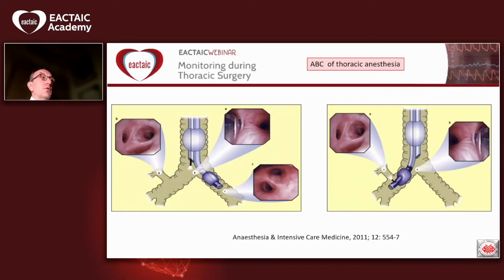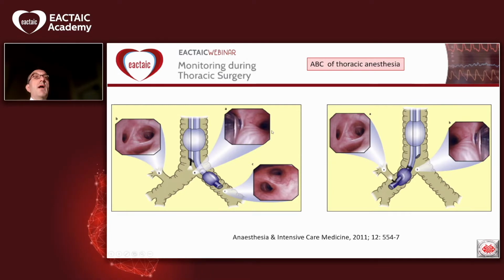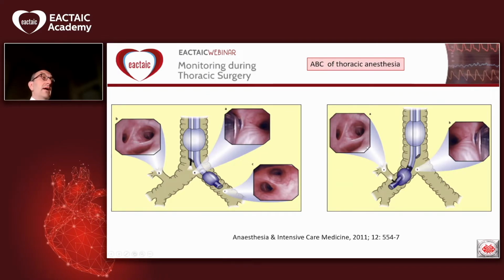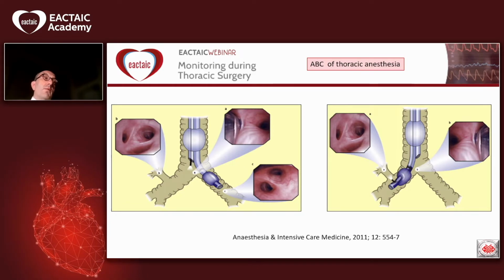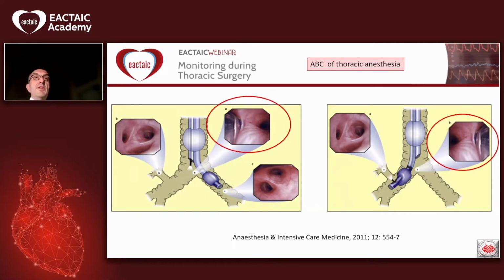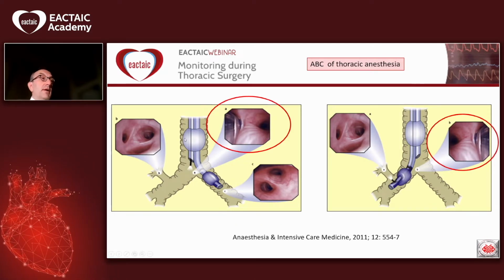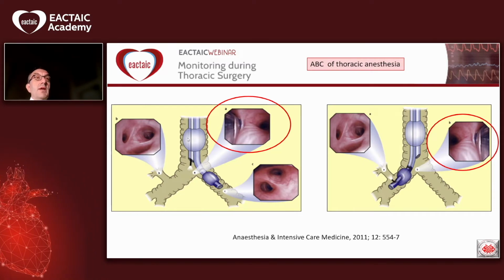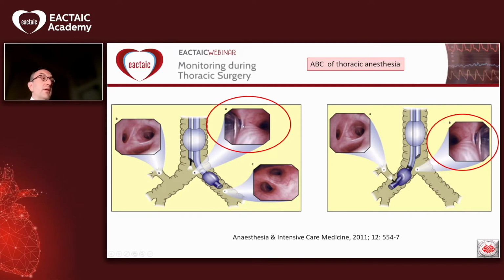B is for the bronchoscopy. This is how we see the bronchial anatomy through the lumens of left and right double lumen tube. Some tricky things. You have to be aware of the unique vision of the right upper lobe here. This is the only bronchus with 3 further openings, and it's usually called Mercedes star. And this is the vision through the tracheal lumen of the left and right double lumen tubes, how you should see the bronchial cuff in the bronchial lumen.